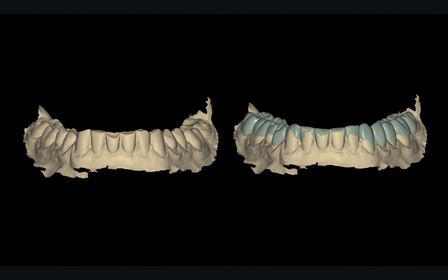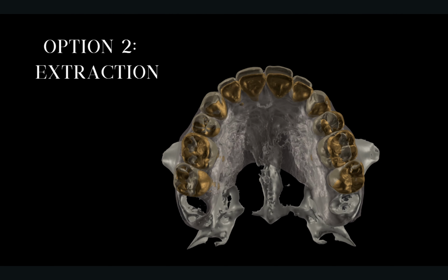So for example, a bite lift. A patient will be coming in and they want to have veneers done, and they'll ask you, Doc, why do you want to put build-ups on my bottom teeth? I'm already spending tens of thousands of dollars on my top teeth. Why do I have to go and spend more on my bottom? And you can show, hey, you're a stress head, you've worn your teeth out, and we've got to put more rubber on the tires. So this is what we're proposing, and this is why you need to invest that additional cost financially and in terms of time to achieve an ideal aesthetic and functional goal.